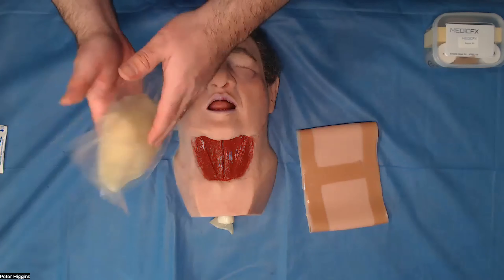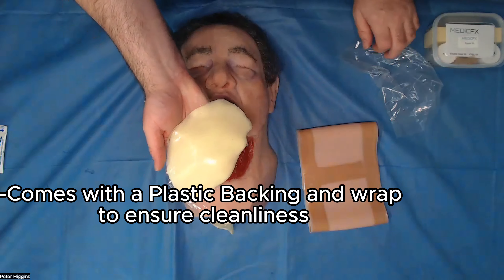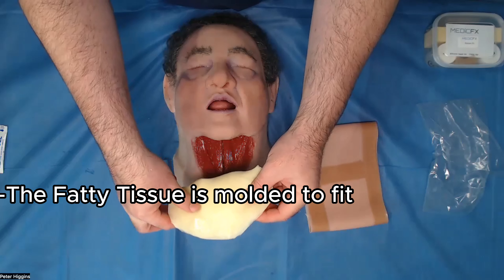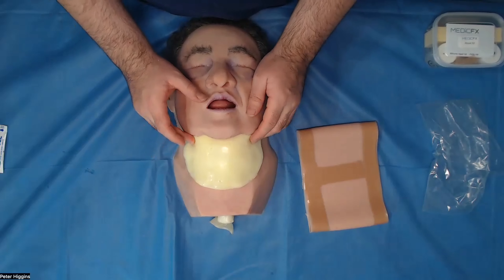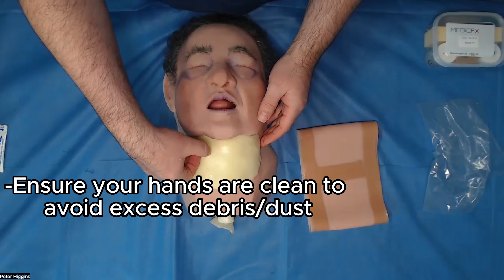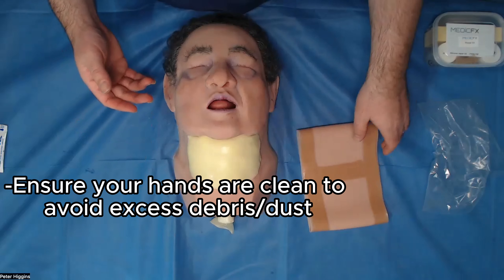So now we're going to take our fat pad. The fat pad itself will have a plastic backing to it and also plastic over the top, because the fat pad is actually quite tacky. I'm just going to peel the backing off here. The top of the fat pad will be moulded into the shape of the jawline. So what we're going to do is just stick this down and then tuck it up underneath the jawline here. Try and handle this with clean hands, as hair, fluff and dust will adhere to the sticky pad.